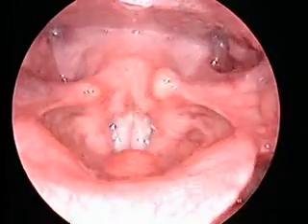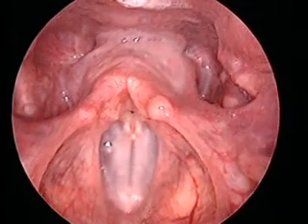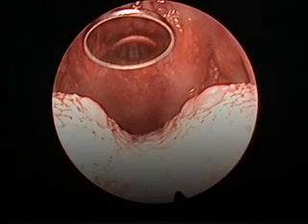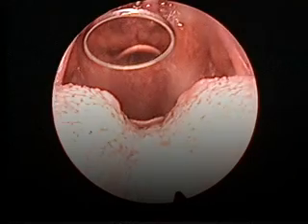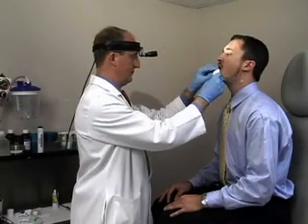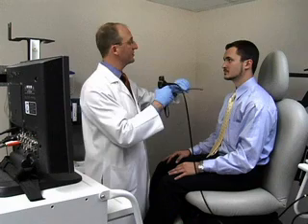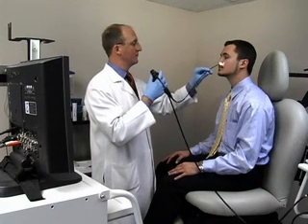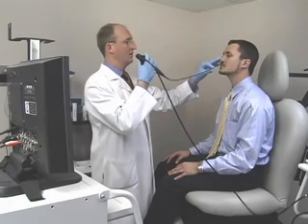Visualization of the larynx and pharynx is an essential part of a complete head and neck examination. Although the location of these structures often precludes direct visualization, simple techniques can be used to evaluate these anatomic structures in the clinical setting. Indirect laryngoscopy can be performed with either a simple dental mirror or with a flexible fiber optic endoscope. These procedures can be performed on patients who are awake and cooperative and are usually well tolerated.